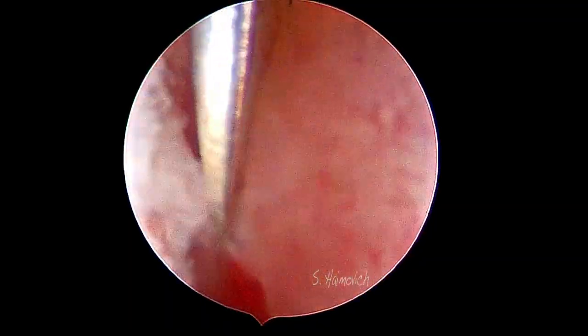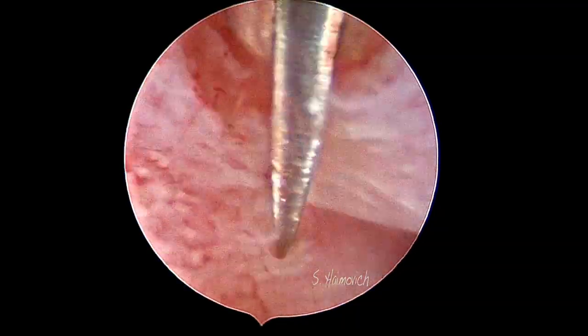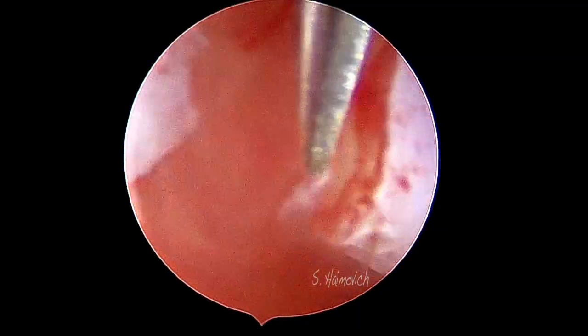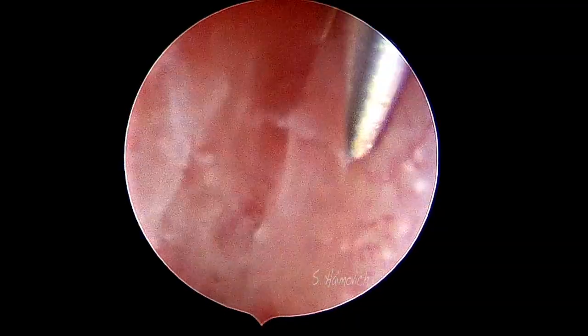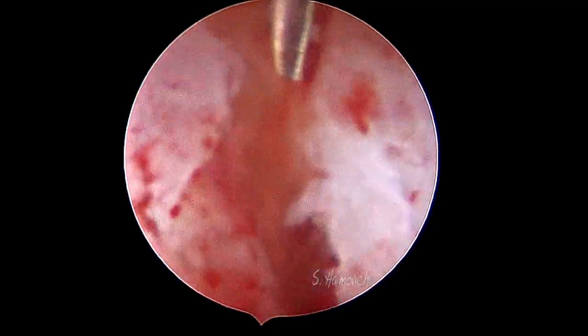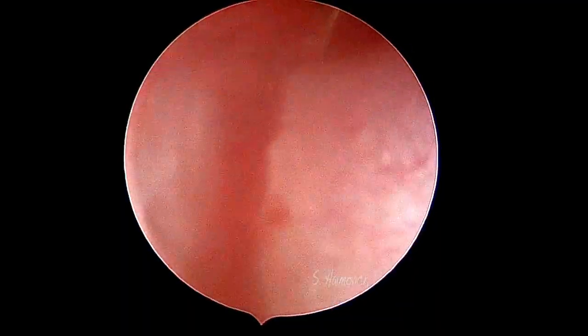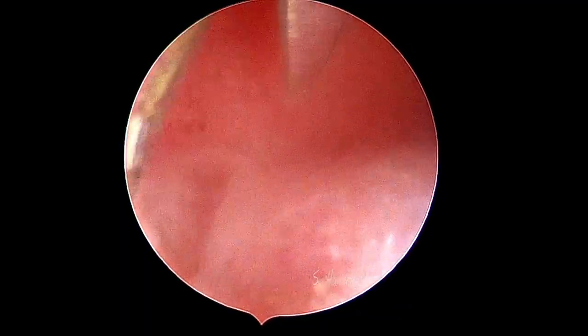We present a case of office hysteroscopy without anesthesia. A right pre-cornual polyp is seen. Using scissors, we cut in parallel to the uterine wall until we free the polyp.